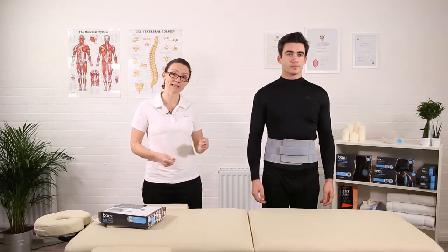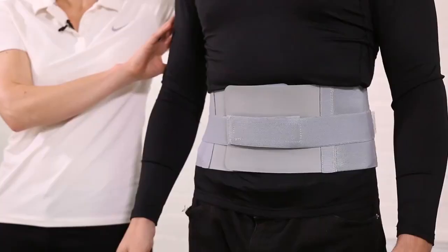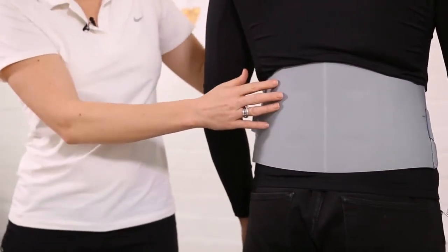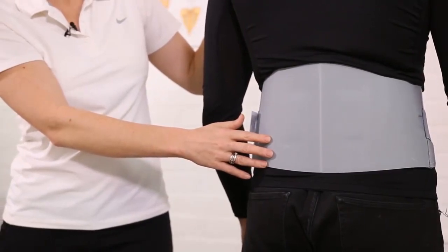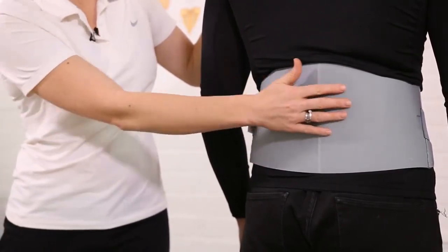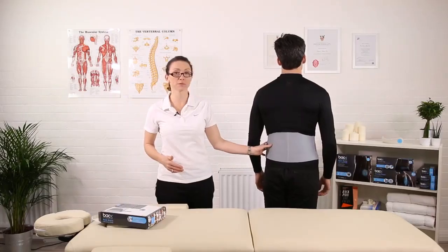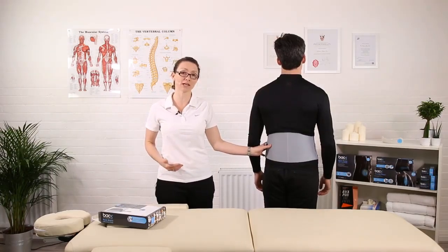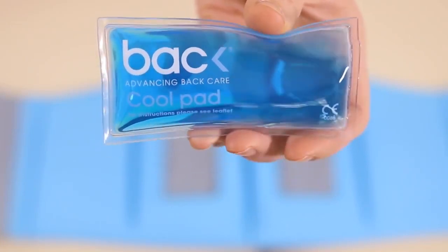These secondary straps are very useful for adding a little bit of extra tension if you want to. As you can see, the brace fits very snugly over the lumbar region, giving you some support and gentle encouragement to maintain a good posture when standing and sitting. A lot of back pain can be caused by tension in muscles and muscle spasms — this will help reduce that tension and improve circulation and blood flow.